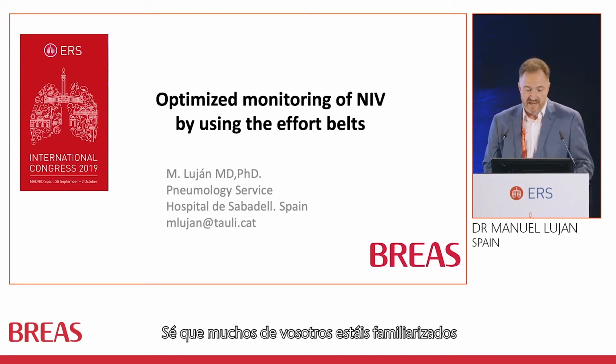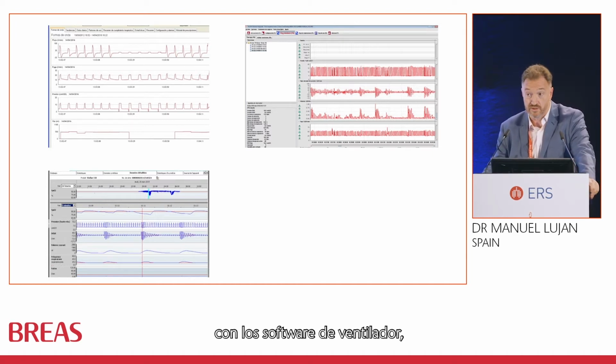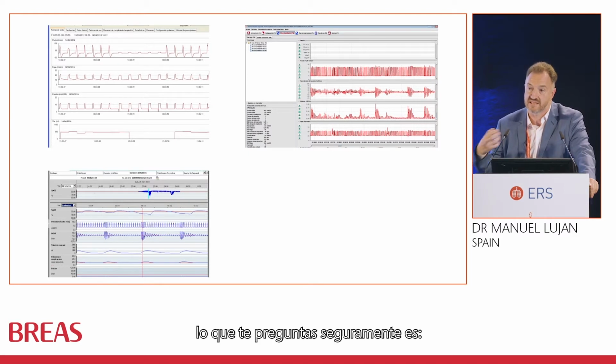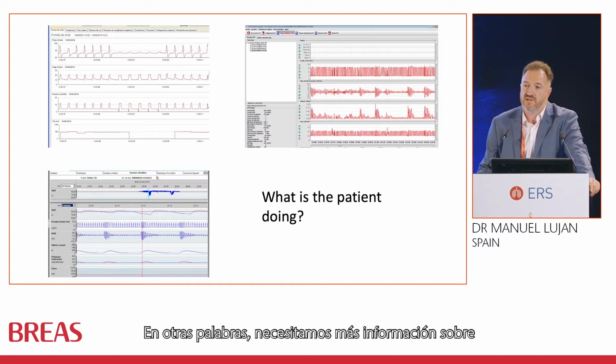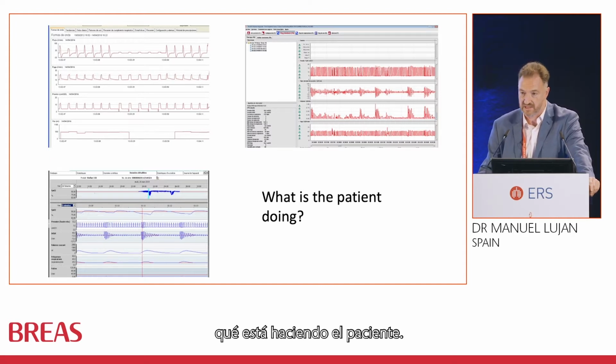I'm sure that many of you are familiar with using ventilator software, and I'm also sure that you have always had to deal with tracings like these, complex tracings with periodic flow reduction. And the question you are probably asking yourselves when you see this tracing is: what is the patient doing? In other words, we need more information about the ventilatory pattern of the patients.